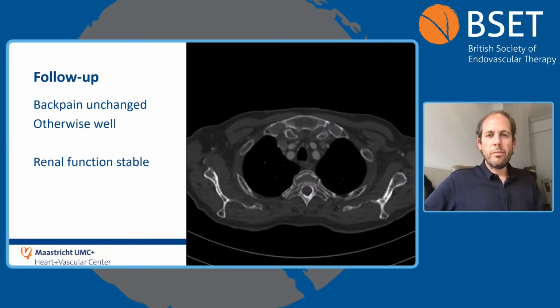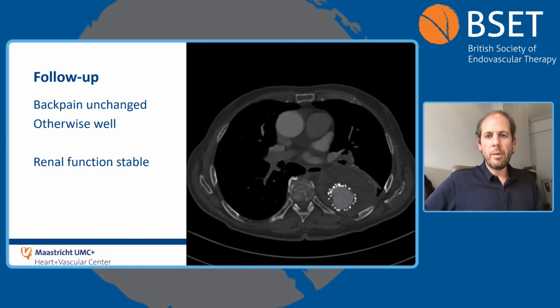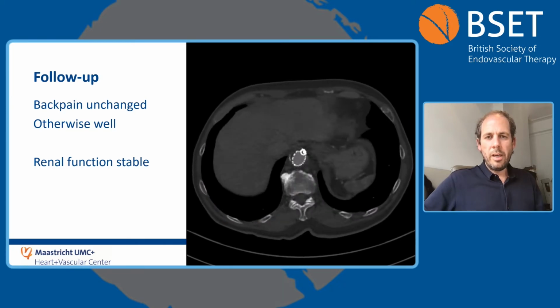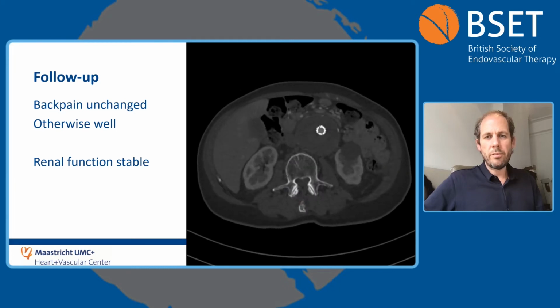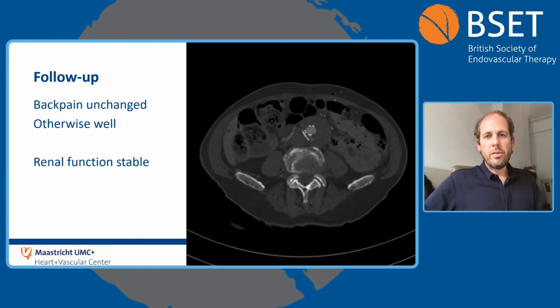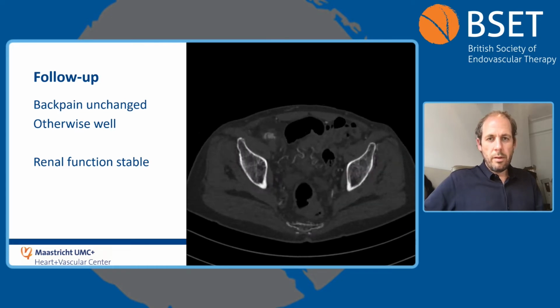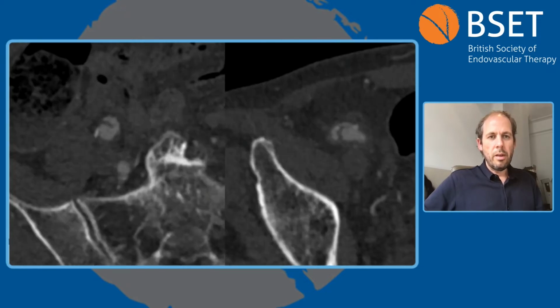This is his follow-up scan, and he's not very long in follow-up. Thoracic bit is fine. Occlusion of the celiac branch. The branches are fine. You may have seen a little endoleak, and there's another one. And here are the 2 endoleaks, visceral and aortic bifurcation, both coming from segmental arteries.